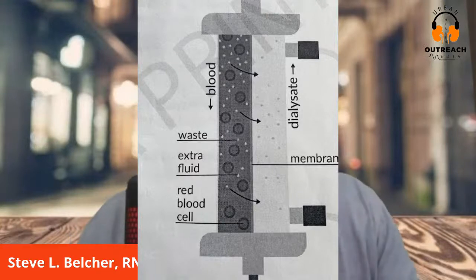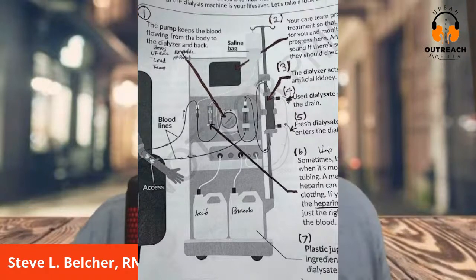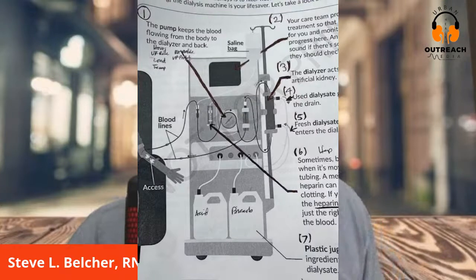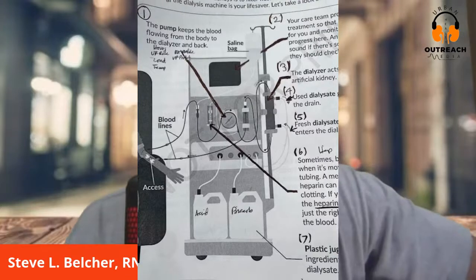Now, when you come down, let me go back to this. When you come down to number four, used dialysate, which is the waste. Five, now you see the solution at the bottom where it says acid and bicarb? That's it. It sucks up those two solutions. You see those lines going in the machine, and there's a mixing pump in the machine, and it makes the dialysate. It mixes this stuff together. And then it comes through where it says number five. The fresh dialysate comes in, and then the used part goes out in number four, where it says number four goes out that hose, the waste and the extra fluid.